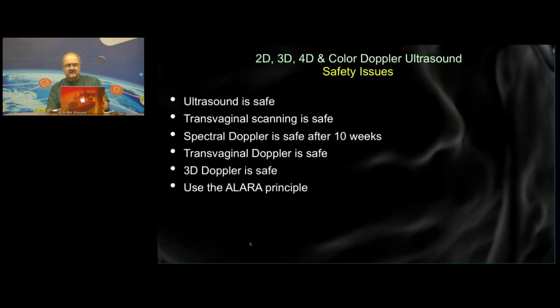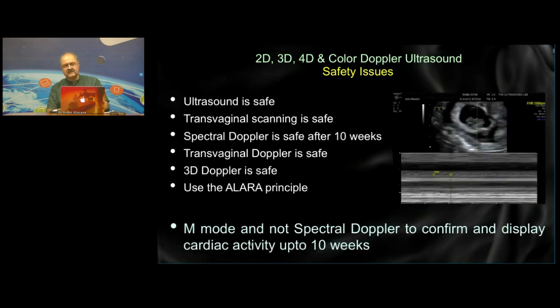And I want to dismiss this with a slide. We don't really need to discuss this because we know that ultrasound is safe. We know that transvaginal scanning is safe. We know that spectral Doppler is completely safe after 10 weeks. We know that transvaginal Doppler is safe, that 3D Doppler is safe, but we always use the ALARA principle, which is that because nobody's proven anything one way or the other, we must say that we will use it for getting an image as low as reasonably achievable. So once I get my image and I get my information, I will stop using it.